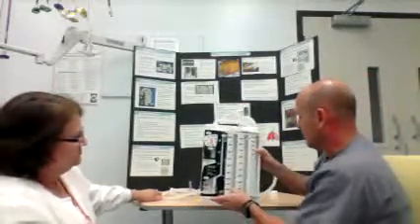Okay? So when you're inserting or assisting a provider in inserting a chest tube, for one of the reasons that we discussed at the beginning, first thing you want to do is identify the patient with at least 2 identifiers. Right. Of course, if it's in a trauma situation, in an ER, that's not quite as pertinent. However, we always identify your patient and procedure within a quick timeout. Yes. And if you haven't learned about timeouts yet, you soon will. Yeah. Because any procedure you do, it's a requirement that you do a timeout. So always identify the patient with 2 identifiers. Verify the signed consent. The patient has to consent to this procedure, again, unless it's trauma and the patient's unconscious. It's in an ER setting.